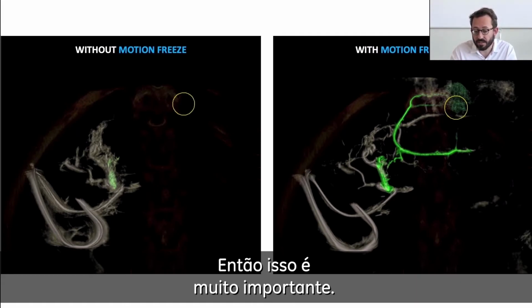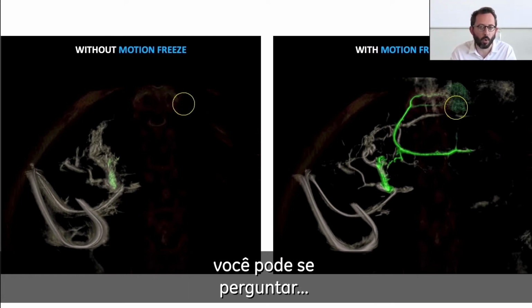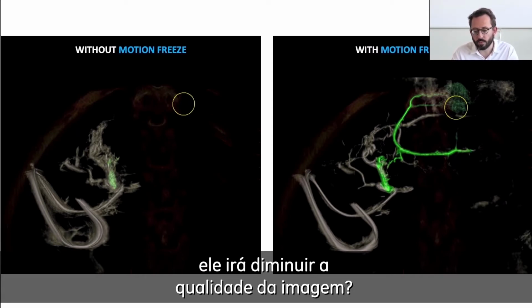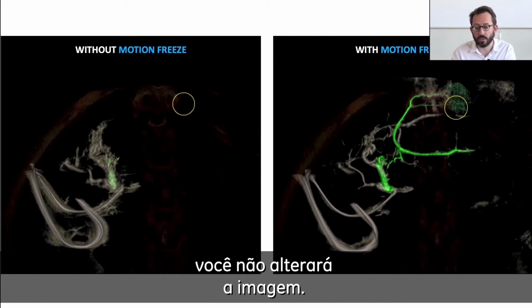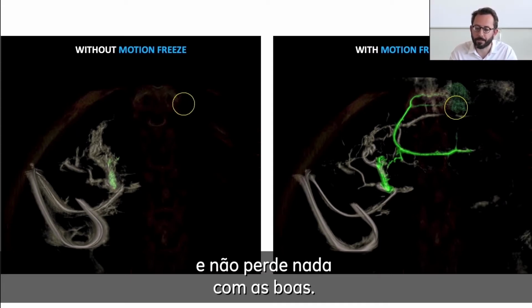You will not give up on using the CBCT. So that's very important. And another thing that is important is that if you use that routinely, you may wonder, yes, but if I use that in a patient that was pretty still, is it going to, I don't know, decrease the image quality? Well, no, we also assessed that, and we showed that when you apply the Motion Freeze algorithm to a perfect CBCT, it will not change the images. So you only gain from the bad ones and you don't lose the good ones.